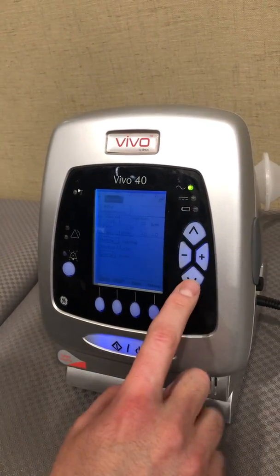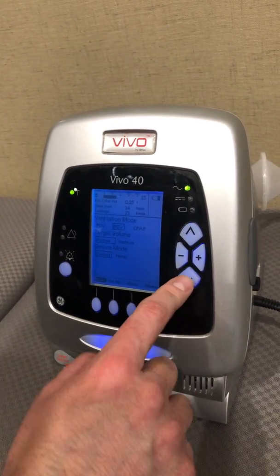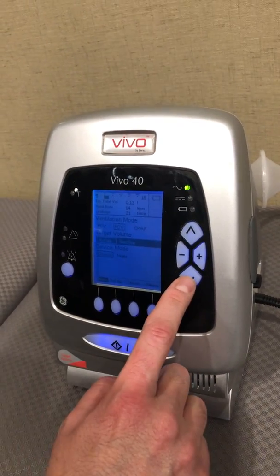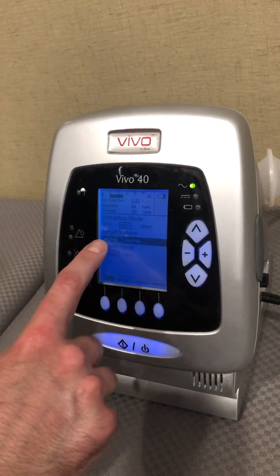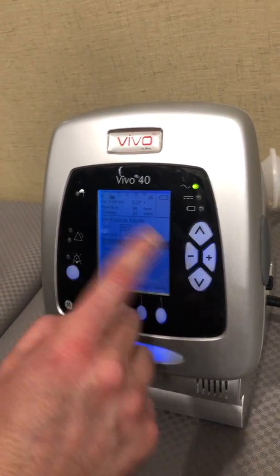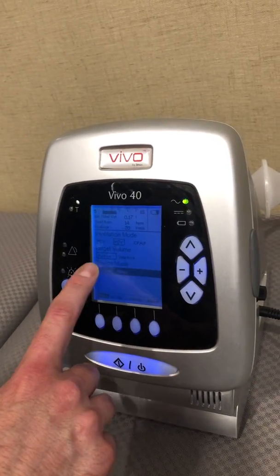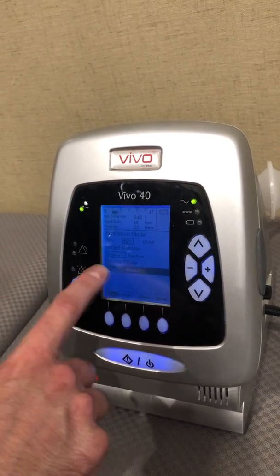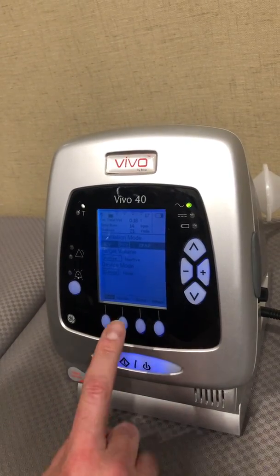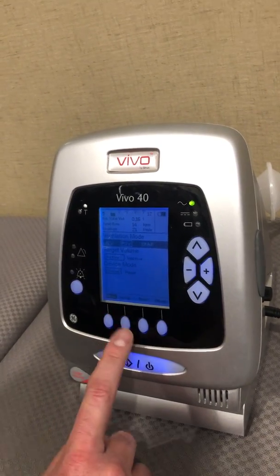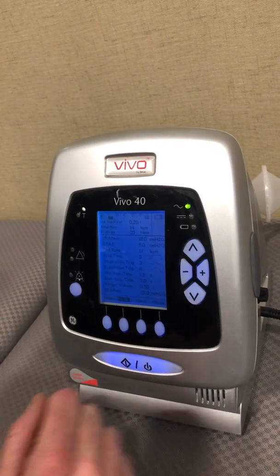Using these arrows, I can get down to my target volume and you'll see it's highlighted active — I want to leave it there. I'm going to go down to device mode: you have clinical or home, and we're going to leave it on clinical. I'm then going to go to setup so that I can set my specific parameters.